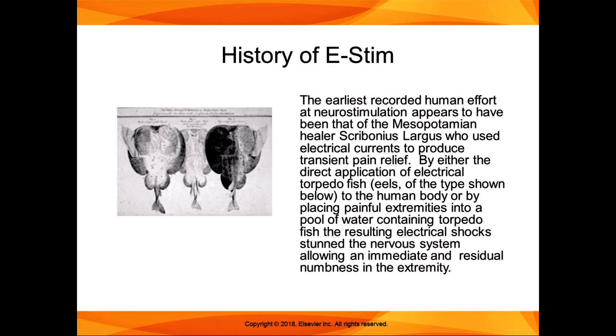So we're going to talk about motor points. Duchenne was a French neurologist who defined motor points, sort of mapped out where the electrical stimulation was most effective to cause muscles to contract. So a lot of the effect that we want to get with electrical stim, sometimes we want to be on a motor point, sometimes we do not want to be on a motor point.